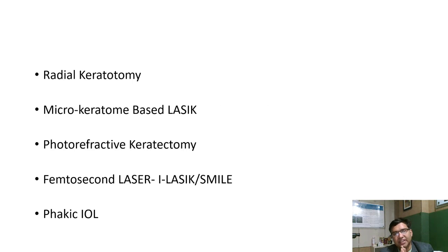Now, what are the various types of refractive surgeries? These are, as you can see in this slide: radial keratotomy, microkeratome based LASIK, photorefractive keratectomy, femtosecond laser, which is used for either femto LASIK or SMILE, and the phakic IOLs. What SMILE is, we will tell you in our further slides. Now, first of all, what is radial keratotomy?